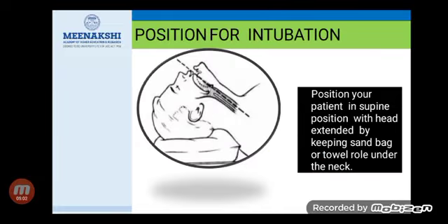Technique of intubation. This is the technique we have to use. Then position: how the position has to be maintained while intubating the patient. Position your patient supine with the head extended by keeping a sandbag, or you can roll a towel and keep it under the neck.